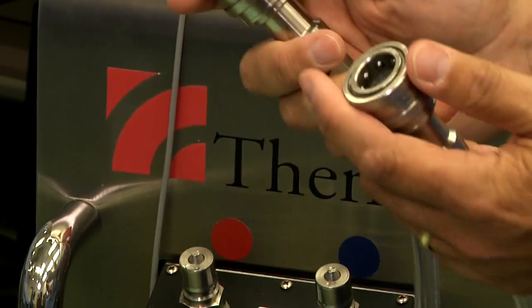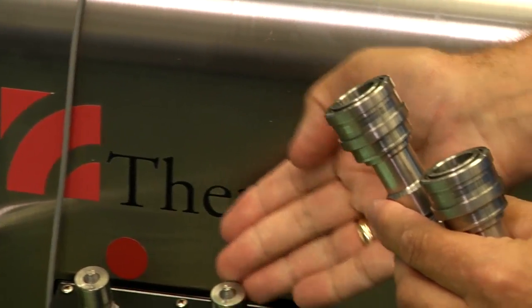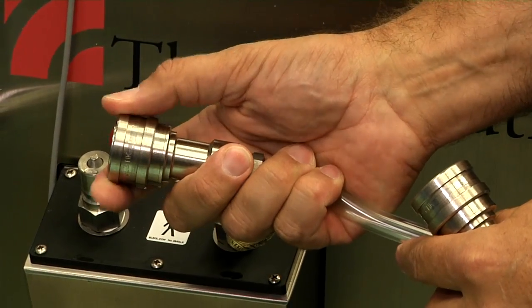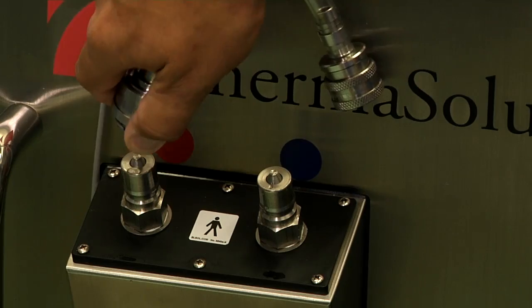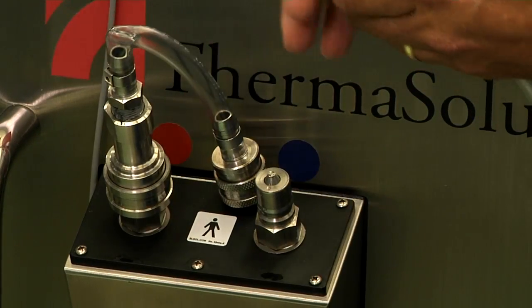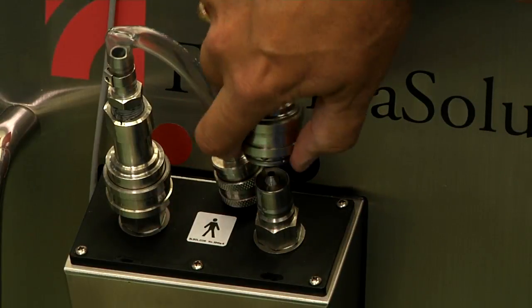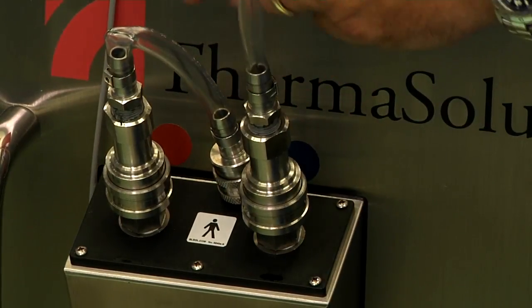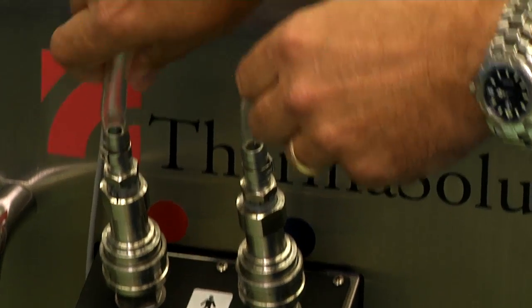There are two water lines that get placed on the water line hookup. The connector is pulled back and snapped into place on both water line hookups, and then you ensure that they're solidly connected.